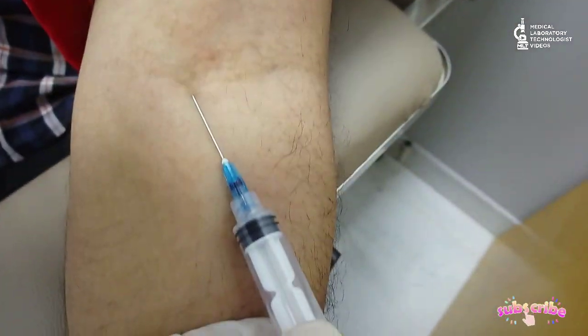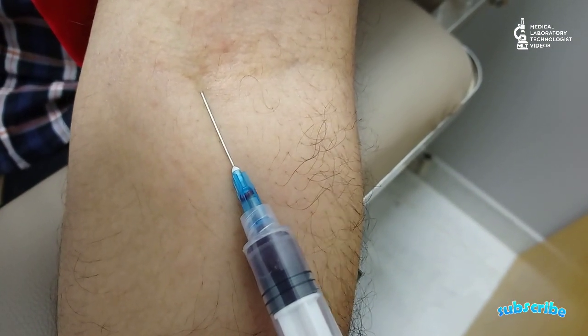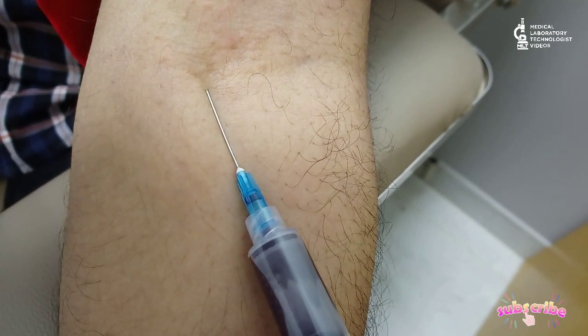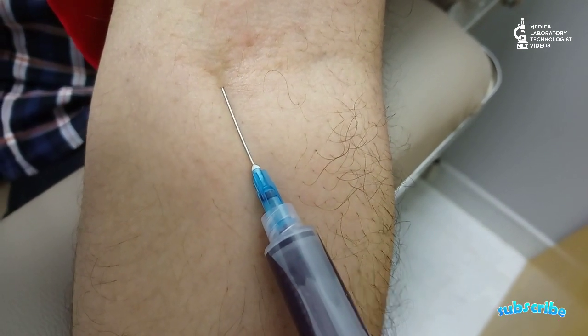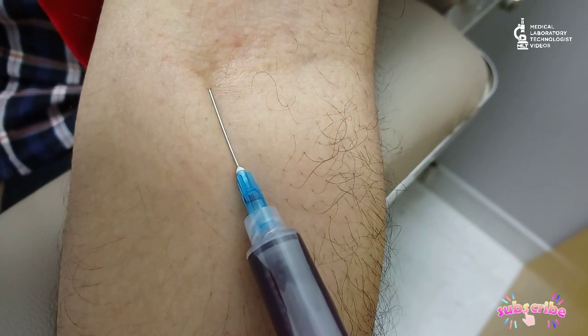Now you can see I've inserted the needle and blood has entered — I stop right there and start to take the sample slowly. Take the sample slowly; taking it too fast will also cause hemolysis of the sample.